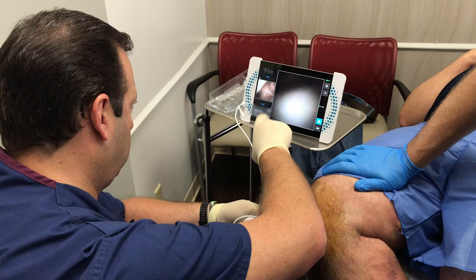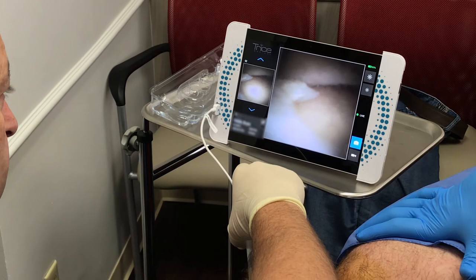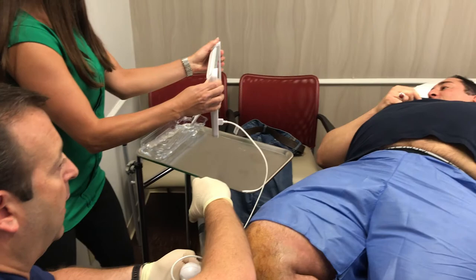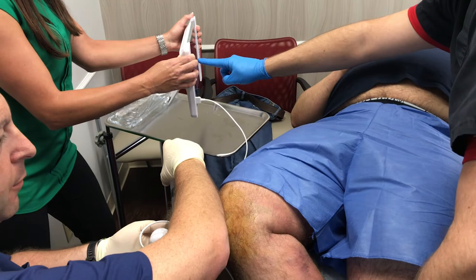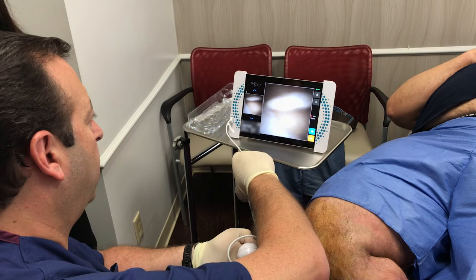You've got a tear. You do — you've got a real tear. It's a pretty good sized radial tear in the meniscus. It's much worse than what the MRI showed. You see that line — this is the normal meniscus coming through here and you see this little projection piece coming out. That's where your tear is and that little flap coming out. There's also a loose piece of cartilage floating around there. So you've got a tear and some loose cartilage.